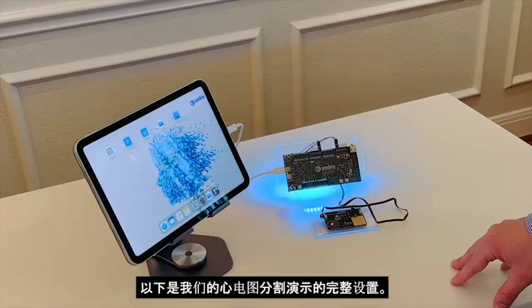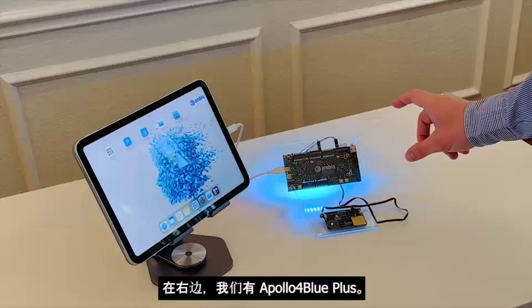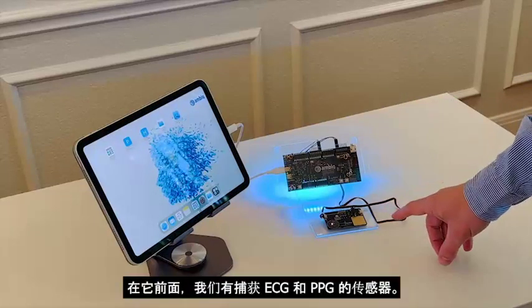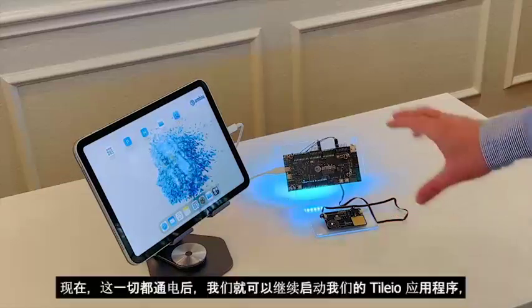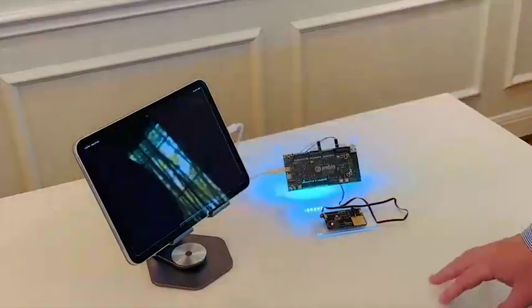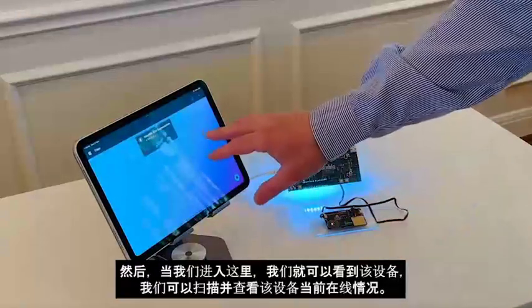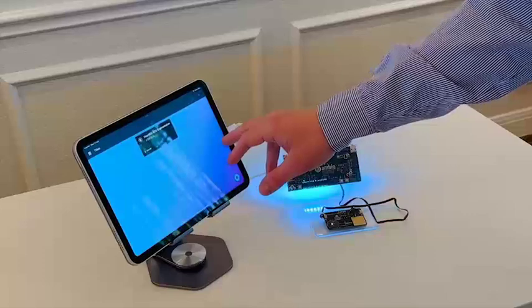Here is the complete setup of our ECG segmentation demo. On the right, we have the Apollo 4 Blue Plus. In front of it, we have the sensor that's capturing both ECG and PPG. Now, once this is all powered up, we can go ahead and launch our Tyleo app. Once we're in here, we can see that there's a device, and we can scan and see that this one's currently online.